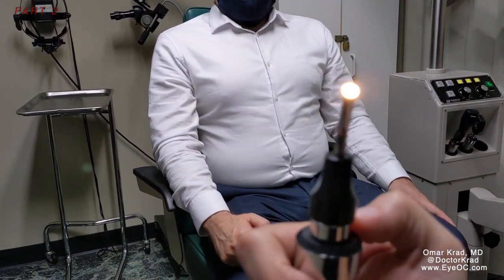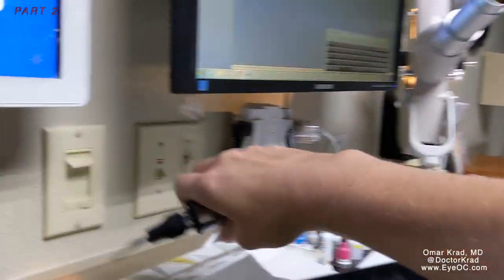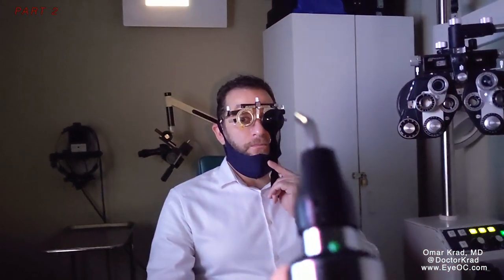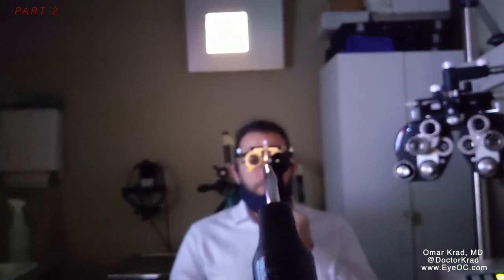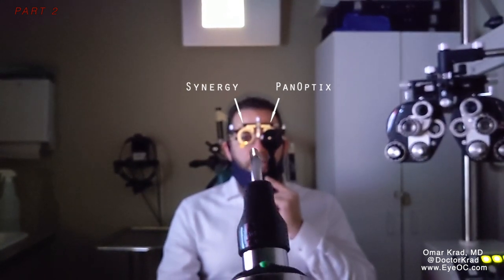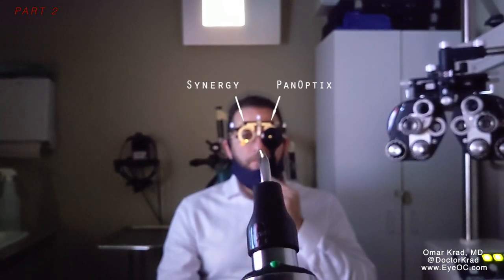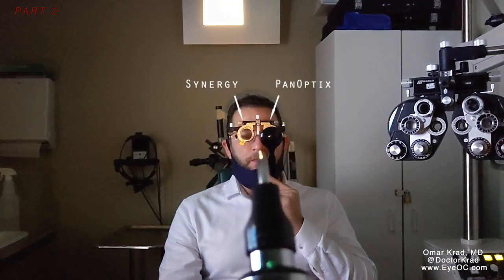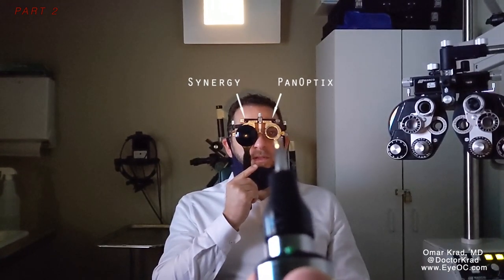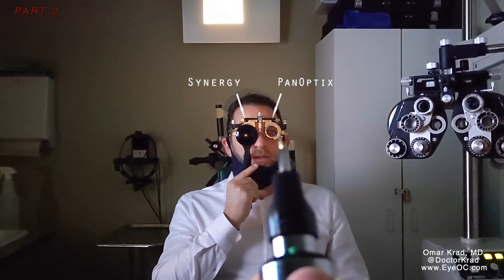Now I'm going to get this bright headlight and dim the lights. So we have a bright light here like a headlight, and I want you to cover one eye at a time. Looking towards that light — does it look different? It's definitely starbursts. Do you see halos as well or just starbursts? A little bit of halos. Now compare to your other side. The same thing but less pronounced — starbursts and halos, but less pronounced.